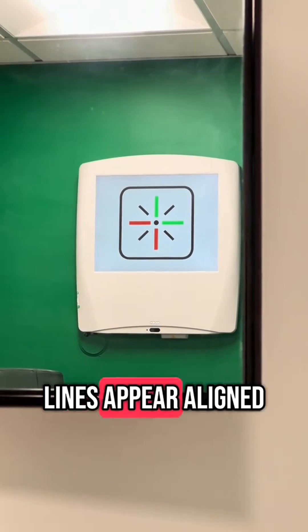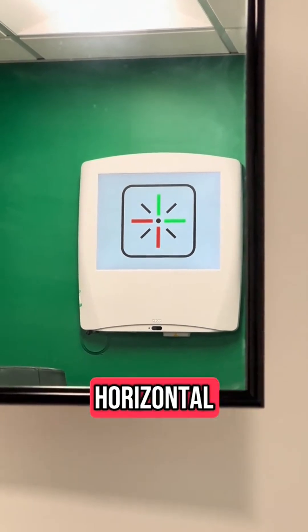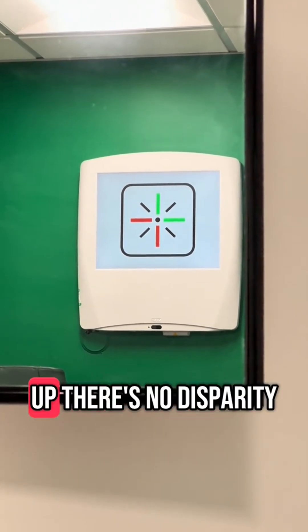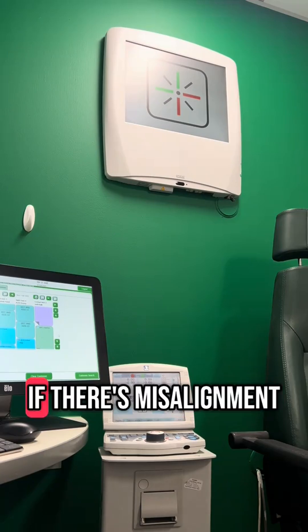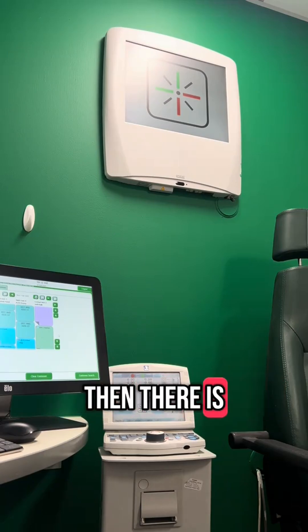Ask if the lines appear aligned. If the lines and horizontals are lined up, there's no disparity. If there's misalignment, then there is.